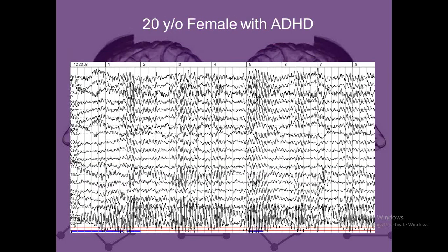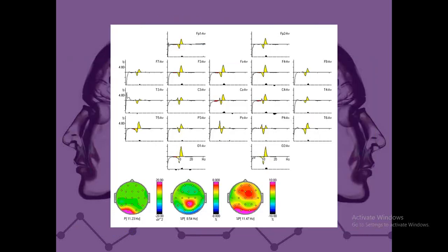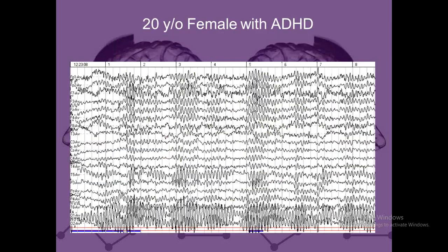Now, anterior hypercoherent alpha, these are the classic cases that are very anxious. Like I say, they can become very obsessed, and these are the ones that respond very well to SSRIs. Now, if you had a fast alpha in this, you couldn't use an SSRI. It's too stimulating. You may have to use something different like a Buspar.